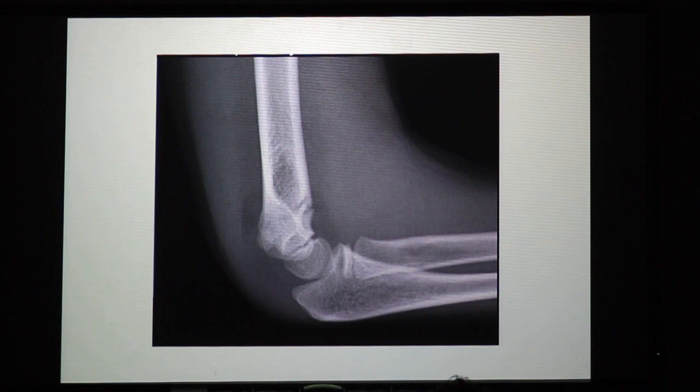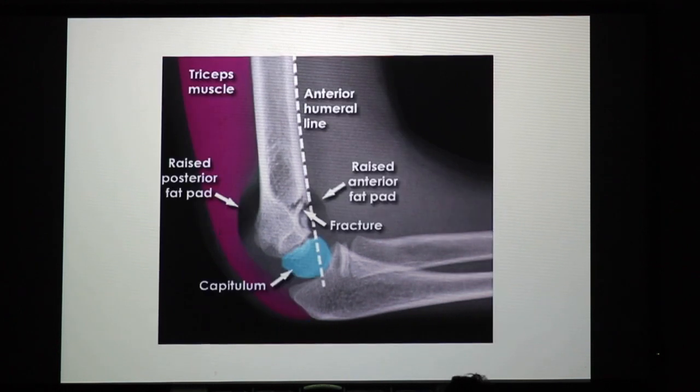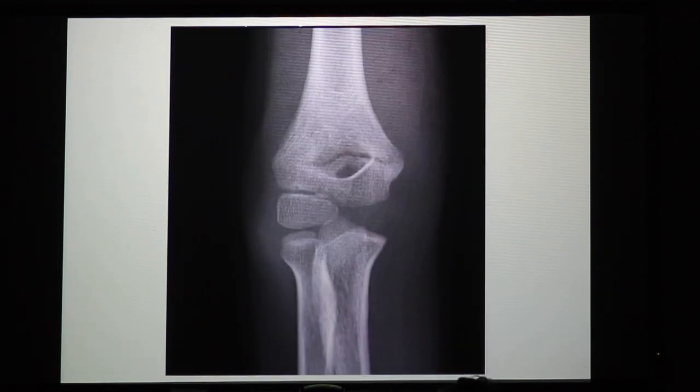Perfect. I appreciate it. So this is happening. And we are able to say the fracture is here, but actually the bones have not fused yet. The process has not completed yet. It's a minor. Now, what's the idea here, guys? Now be careful.